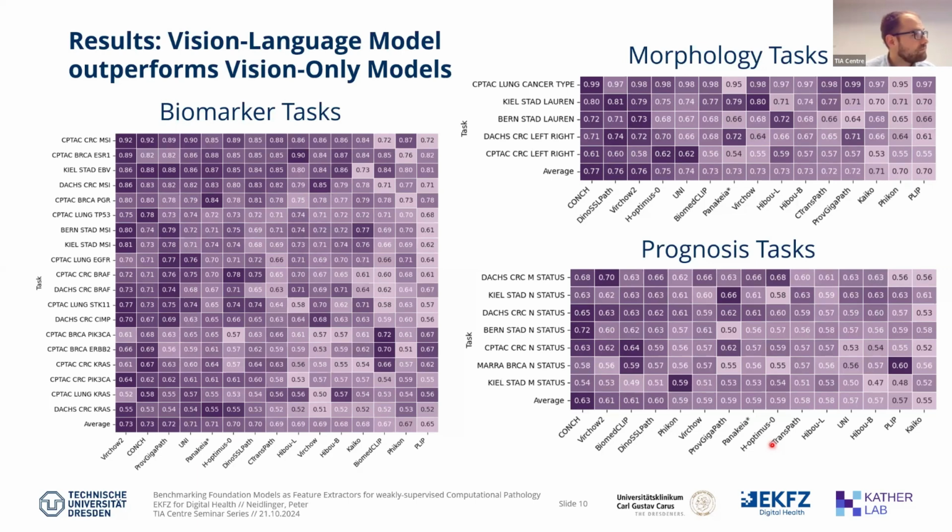Or if you want to fairly compare different models, let's say the last row, DACHS, I don't know exactly how many cases are inside that one, but do you think it can be considered like adding a weight when you're comparing those performance results? Maybe the last row has less weight, but the first row has the most weight. Do you think that's maybe going to be a confounder or influence the comparison?